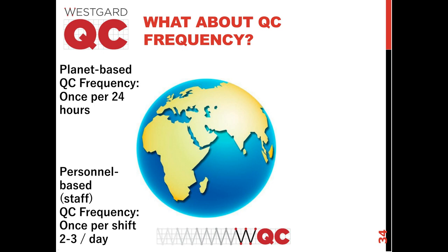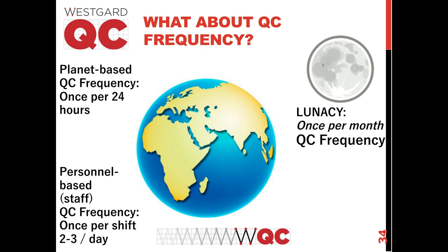Sometimes there is an increase, maybe 2 or 3 times a day, once every 8 hours. It might match with how often we have different shifts. So, you know, we're not basing it on the planet, now we're basing it on our personnel. And then those of you in the point of care area, you know that there is also this once a month QC policy called IQCP, and that is literally lunacy. Once per month running QC, that's inadequate, and you might be howling about it.